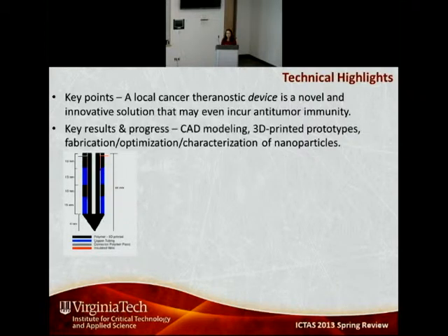So there's supposed to be a cartoon showing a cross-section, this would be the SolidWorks image, and at the top was supposed to be a cross-section of the CAD drawing showing the needle. Basically what we have is a base needle that is hollow all the way through. With that hollow chamber, we can feed fiber optic microneedle devices. The objective is to work with Crystal Rylander and put these FMDs through the center of that to do photothermal therapy and co-delivery of the nanoparticles.